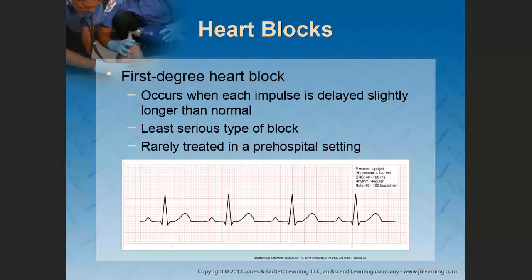All right, let's look at this rhythm. This is to give you an example of how subtle the changes can be. Now, does the rhythm look pretty or ugly? That's the first thing. Is it an ugly or pretty rhythm? It is pretty.